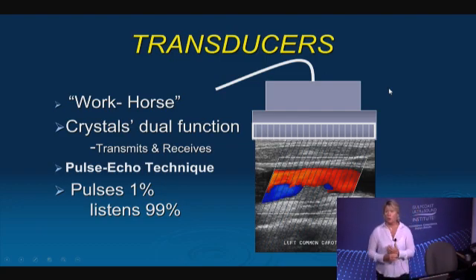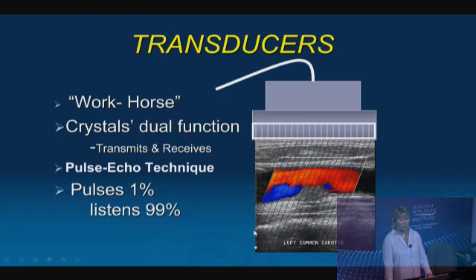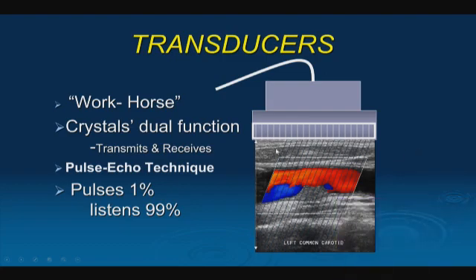Most transducers that we're currently working with have multiple elements. We call the transducer that we hold in our hand the transducer, but it's really the scan head, but those terms are kind of used interchangeably. Again, the transducers are these elements that are housed within the probe, and most transducers have multiple elements. So when we apply the electrical voltage, the signal goes out into the body, it comes back to the transducer, it's converted into a radio frequency signal, and that happens very quickly, and all of these elements are pulsed in succession. Depending upon the type of transducer determines how the elements are pulsed.